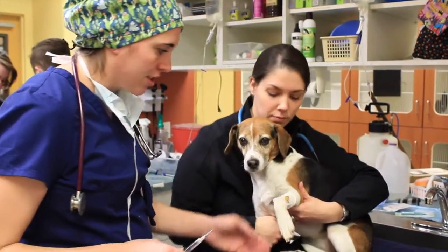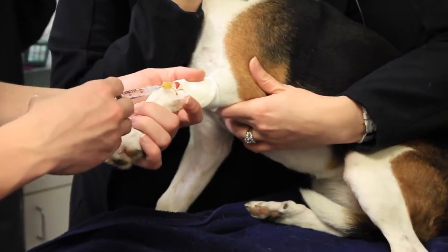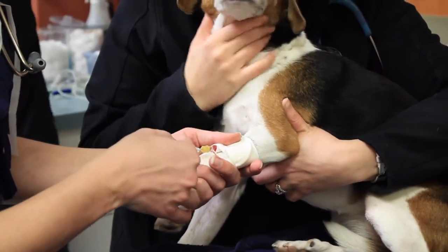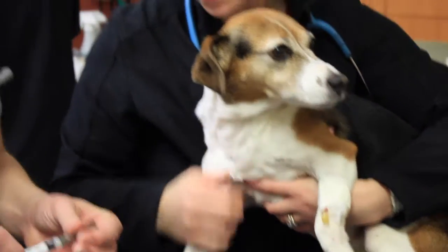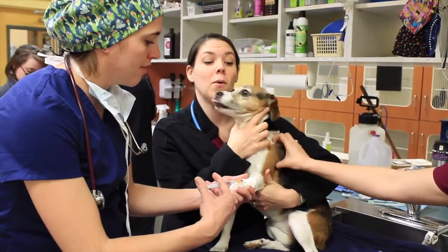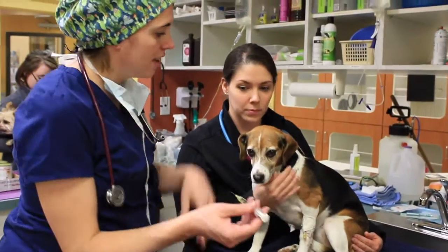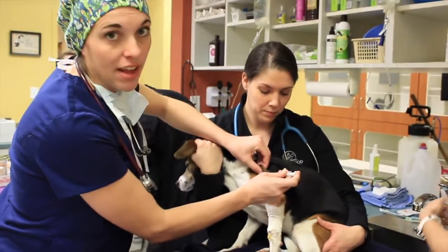This first one is just flush — this will double-check our IV catheter. That is good. This next syringe is the medication. Because we're giving it directly into the vein it'll act pretty quickly. This next injection is a pain medication — it's a different type, it's an anti-inflammatory. We'll go ahead and get this on board too since we know she's going to have that mass removed.